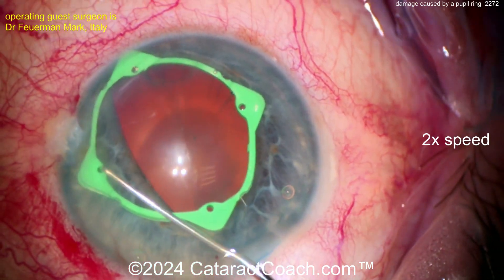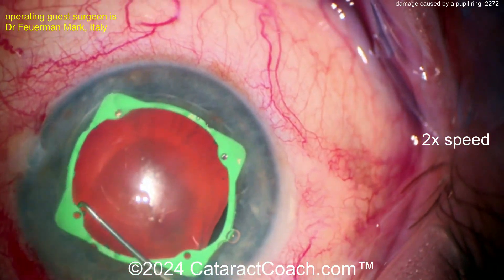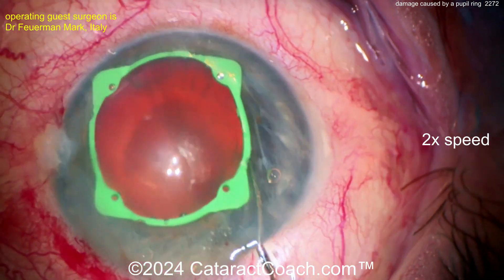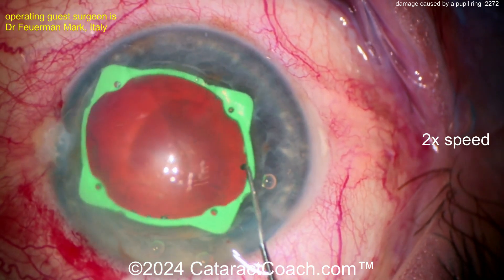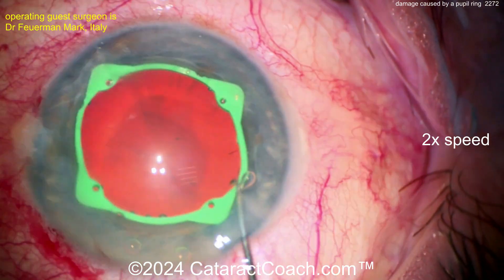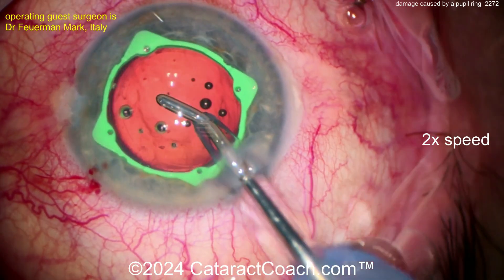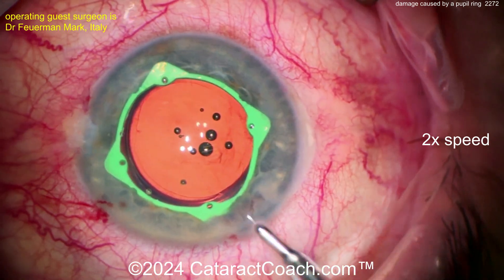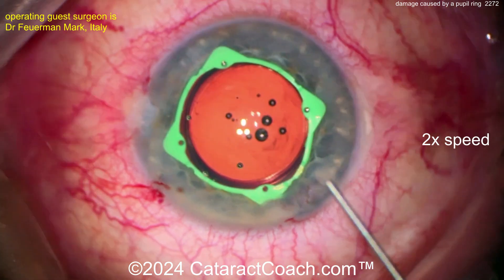We get the whole spectrum of patients — all different color irises. Now that looks pretty good. Get that ring centered up — that looks very nice, actually. Let's complete the FACO. The FACO is pretty easy. Let's cut to the end of the case, that's the important part. IOL in the bag — looks like a good case.